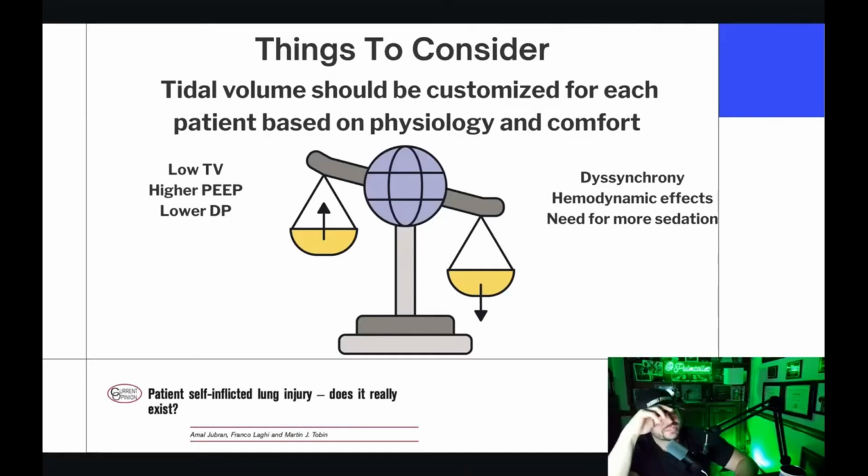It's another way that you can tell if the patient's still air trapping, right? So if your end tidal doesn't plateau, if you have that shark fin, then by definition that means you haven't plateaued your PCO2. So if you start another breath, you're air trapping by definition. So I think it's helpful in that situation.